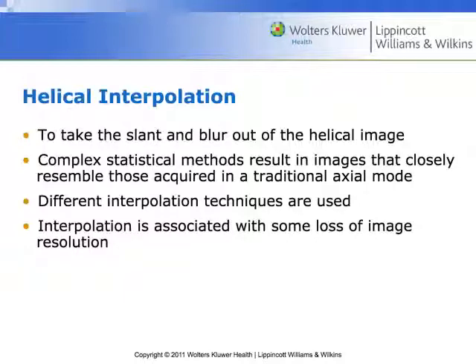And so it's going to start interpolating data in different ways. That can result in a number of things. Like, for example, the ways that we used to measure certain pathology, like lung nodules, is literally changing right now. As we're talking, there are a lot of decisions being made about the way that we view this information. And that will probably be the case of CT for the rest of my life. It will continue to be one of the most rapidly evolving fields, along with, I think, nuclear medicine and MRI.